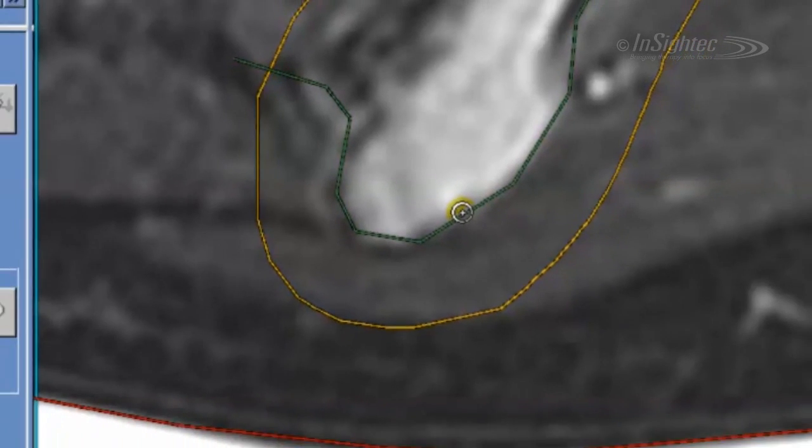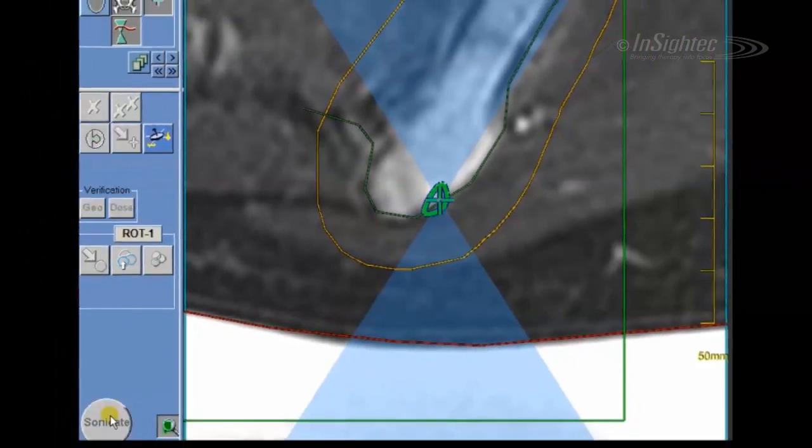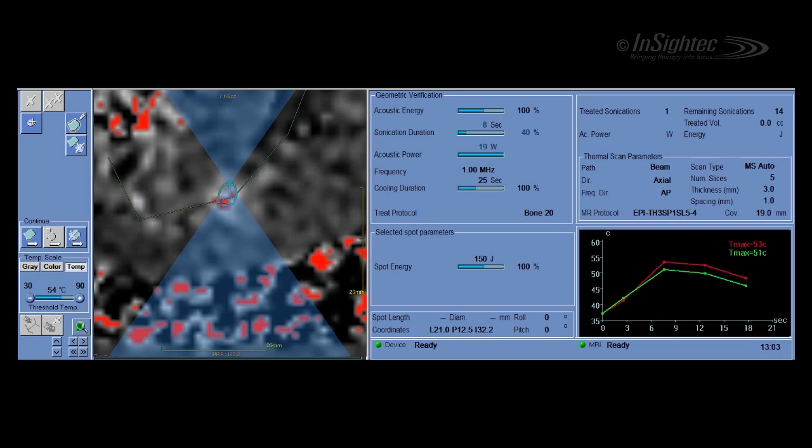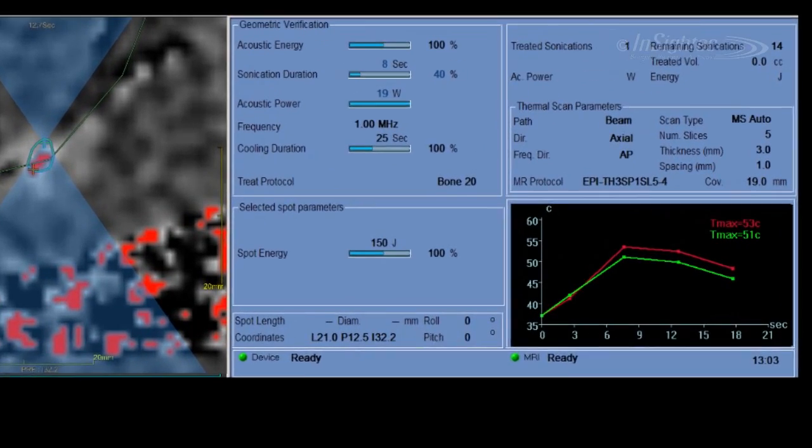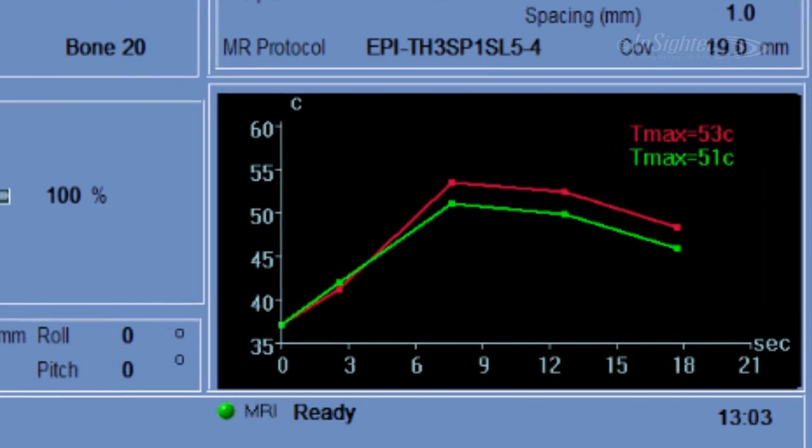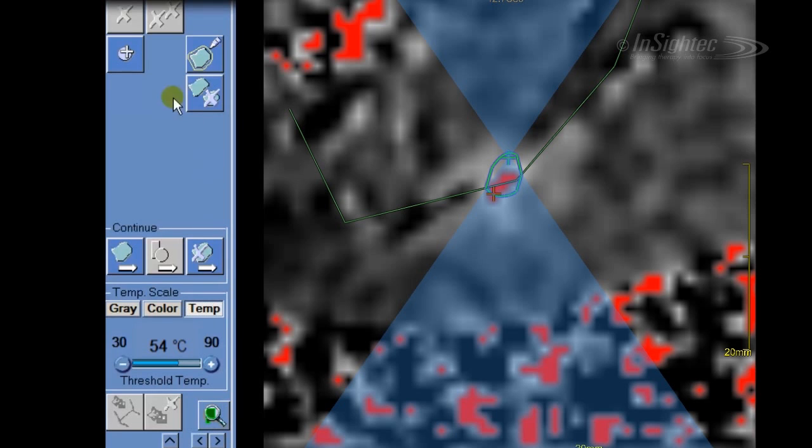Targeting accuracy is verified using a low sub-therapeutic test sonication. This identifies the point of actual energy delivery. Adjustments can be made to correct tissue-specific beam deviations.